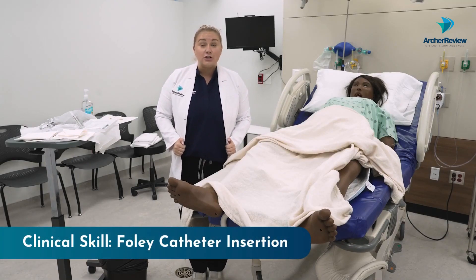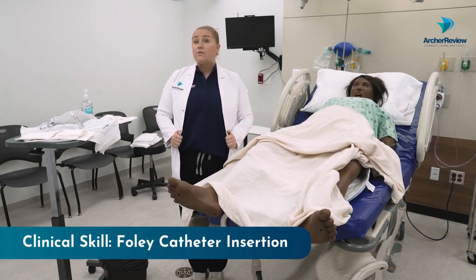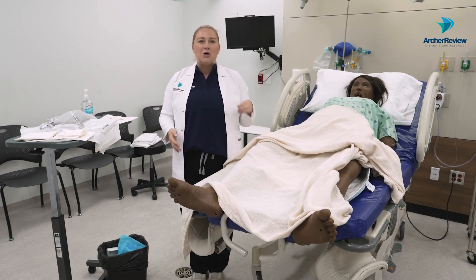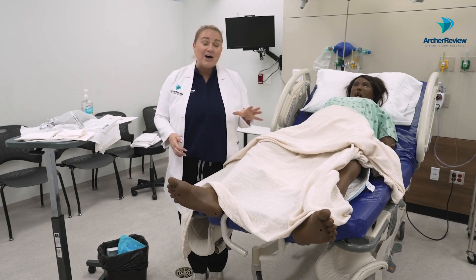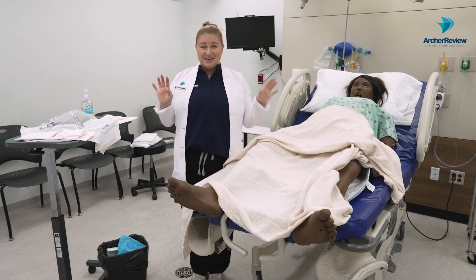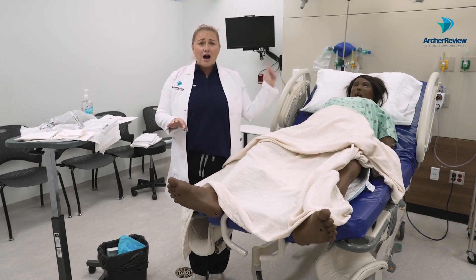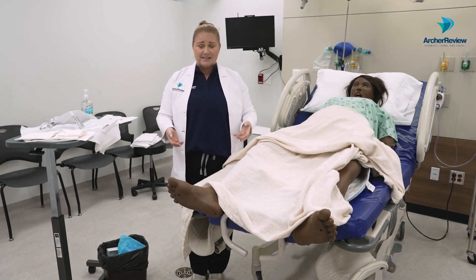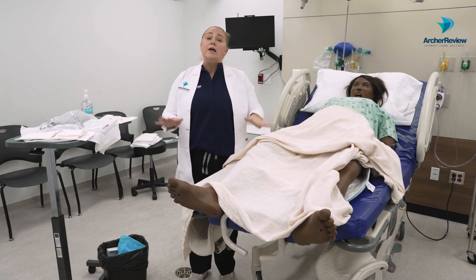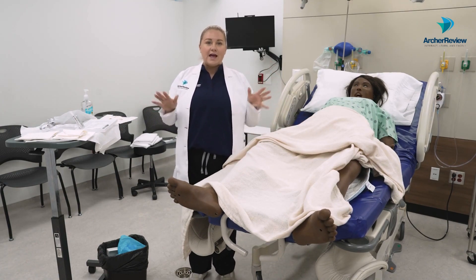Hey there everyone, Dr. Taylor with Archer Review, and today I am going over Foley catheter insertion. This was one of the skills I get really anxious about because it is sterile — we don't want any bacteria making their way up the urethra into the bladder causing cystitis. We have a client here today; she's in labor, she's had an epidural, and now she needs a Foley catheter.